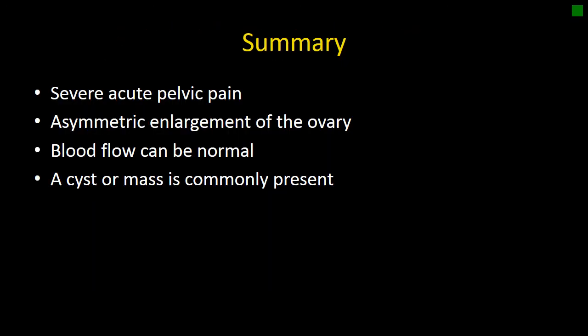In summary, ovarian torsion tends to present with severe acute pelvic pain. First look for asymmetric enlargement of the ovary and note if the ovary is abnormally positioned. Remember, blood flow can be normal — lack of blood flow or abnormal blood flow is highly specific but not sensitive for torsion. A cyst or mass is commonly present in the setting of torsion, oftentimes being a predisposing mass but sometimes being the result of hemorrhage within a follicle or cyst.